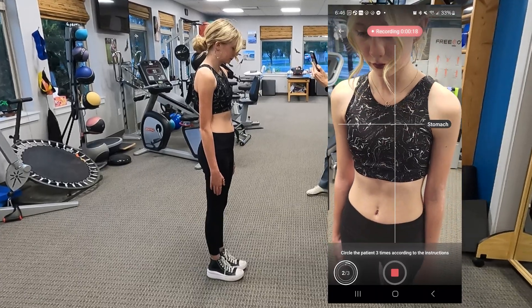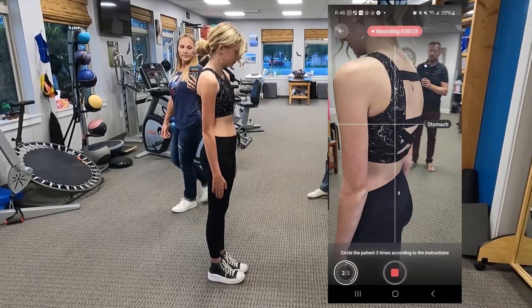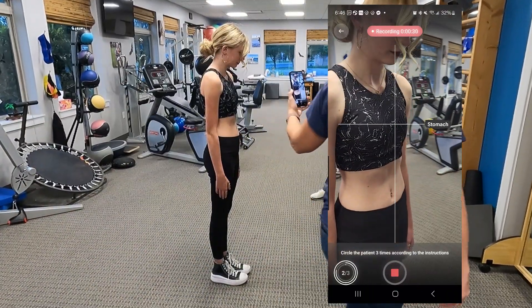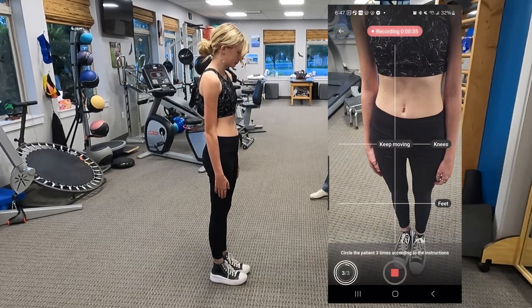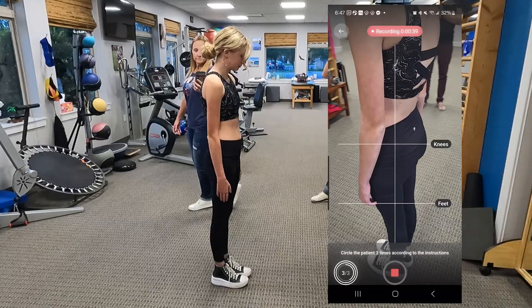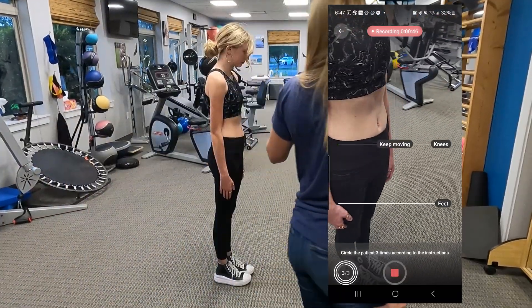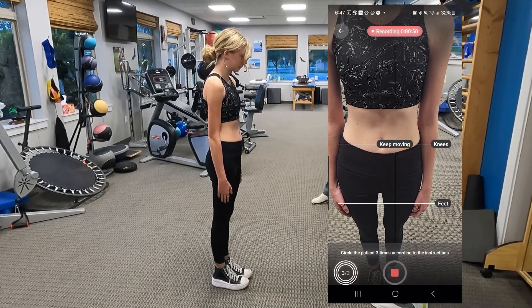Then we'll go down to chest level for the second circle. What the technology is doing at this point is creating a 3D map or image of the spine, so it needs to be able to see different areas of the back. One thing that needs to happen is you need to make sure you get the feet in the last circle, because it uses the feet as a reference for where the person is.